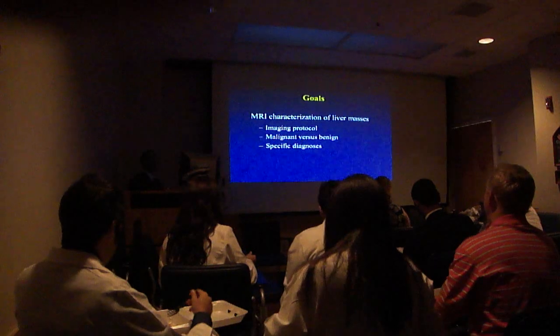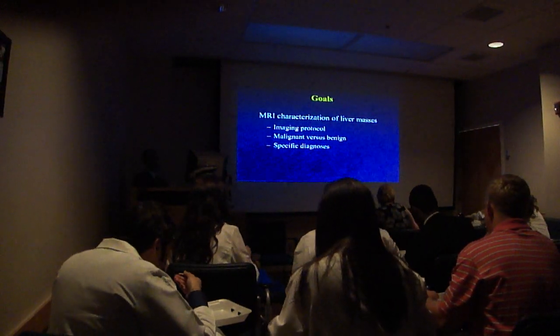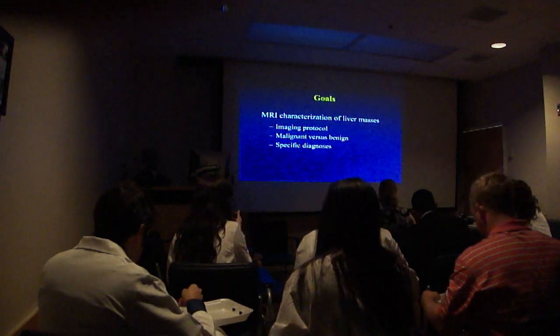Goals of the lecture. Characterization of liver masses. We'll discuss the imaging protocols. Malignant versus benign and specific diagnosis.